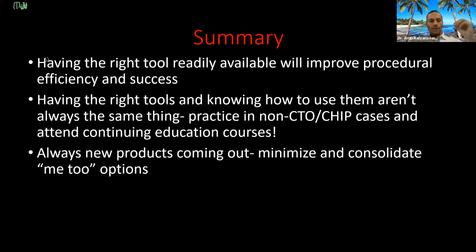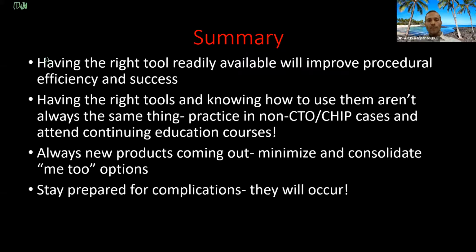Try and avoid me-too products. You don't have to have every wire that's there. For example, I don't stock Gaia Ones. I just have 3s. Sometimes I have 2s. I tend to keep XTRs. I don't use a lot of XTAs because the tip is 0.6 versus 1, very similar wires otherwise. So try to pick your wires, be comfortable, and keep an inventory that you can manage.